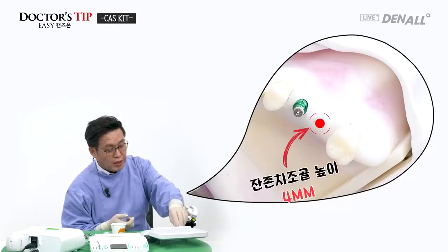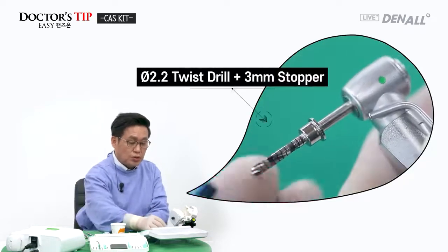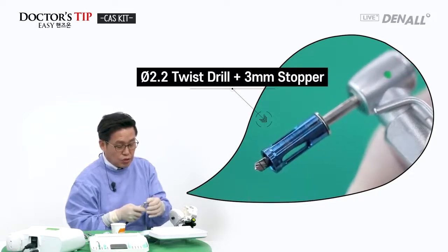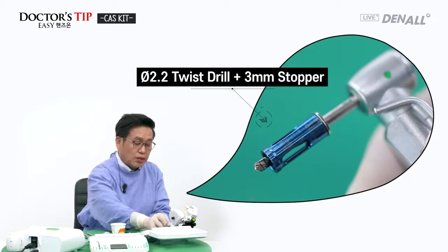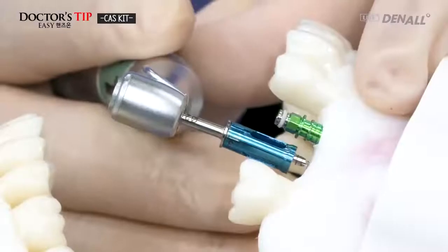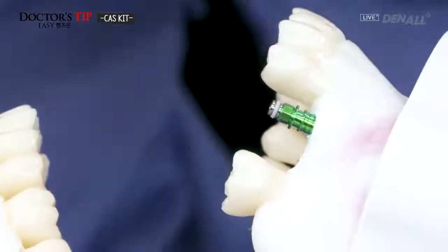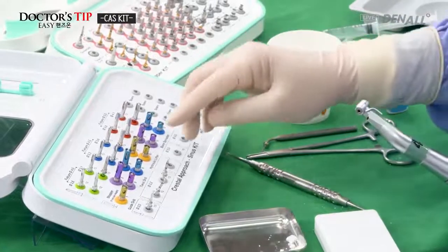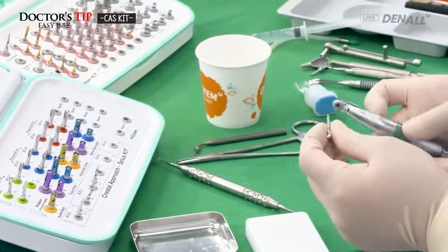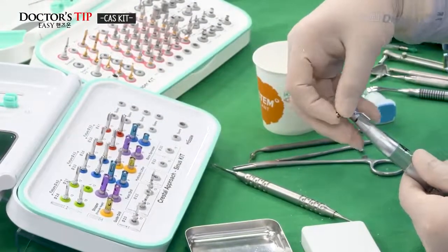At 26, the residual bone height is 4 millimeters. The 2.2 twist drill will use a 3 millimeter stopper, 1 millimeter less than the height of the residual bone. Drill hole is made. CAS drill: a 3.1 diameter CAS drill and 4 millimeter stopper is connected to advance 1 millimeter.